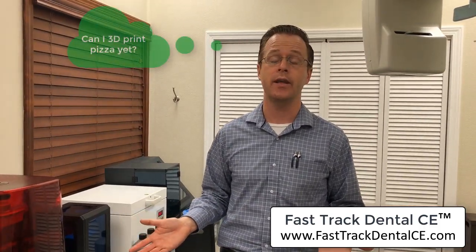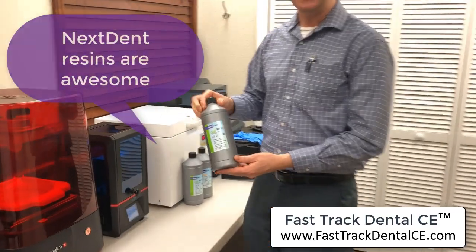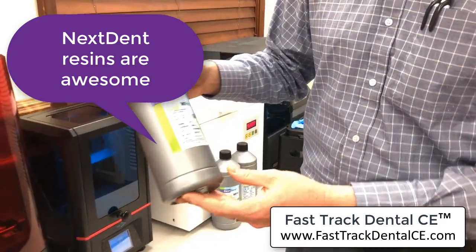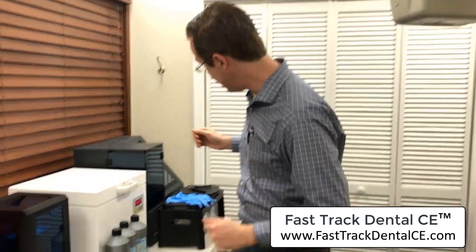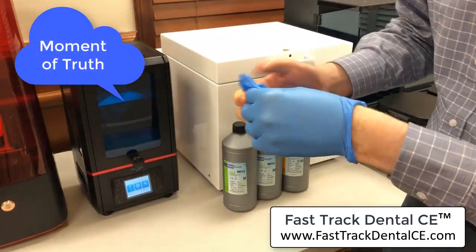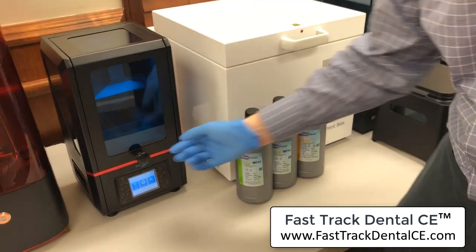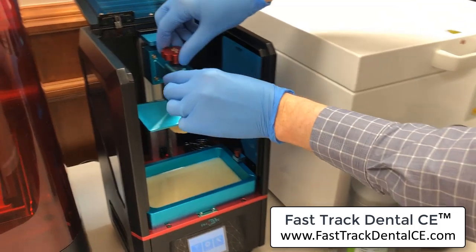I clicked in a little USB key right into the back of the 3D printer, turned it on, and clicked print. What I really wanted to put it to the test with was NextDent resins. So I went ahead and 3D printed a full arch prosthetic using the NextDent CNB MFH, downloaded the 3D printing profile that Renaldo worked on with help from Rick. If this thing can do this on the first print, it's got incredible promise.